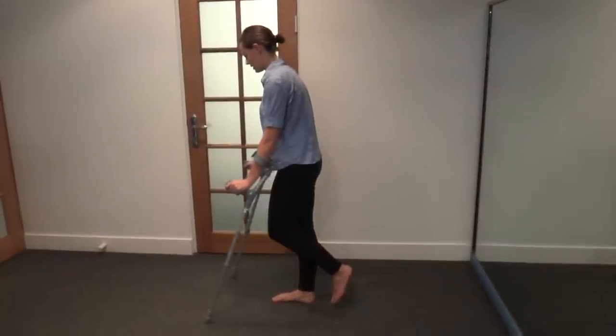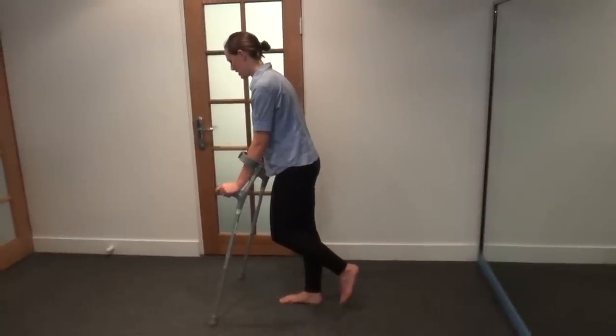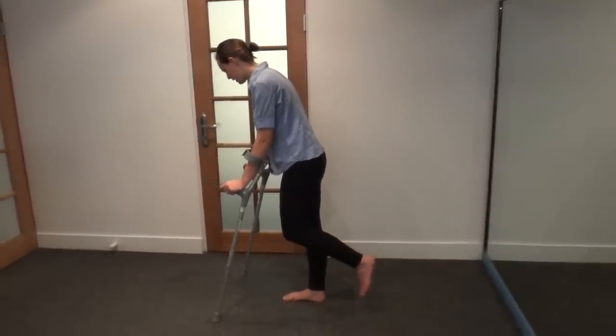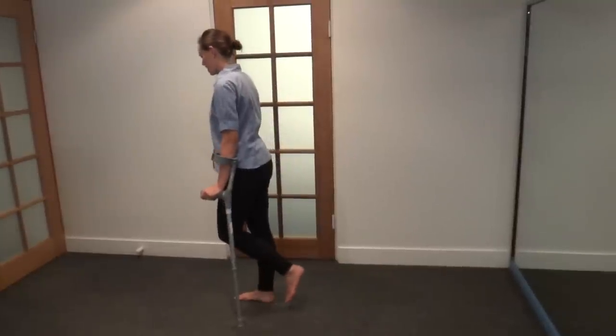Again, put your crutches a short distance in front of you, making sure they're wide enough apart, making sure your foot is clearing the ground, putting your weight down through your hands, and hopping to the line of the crutch.